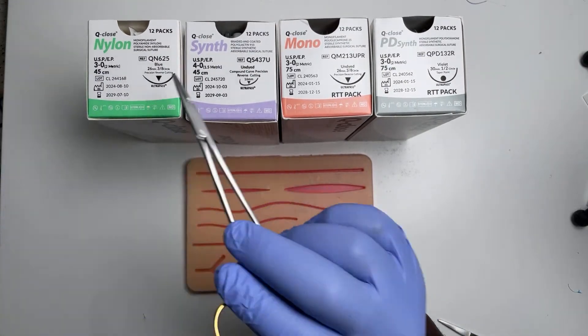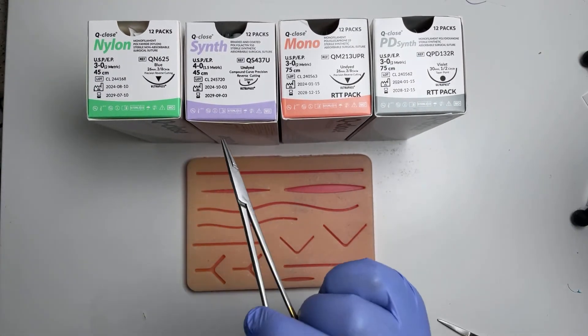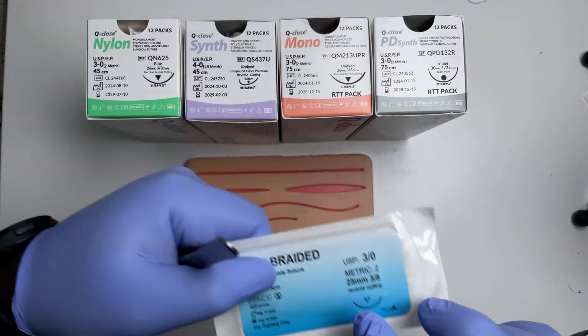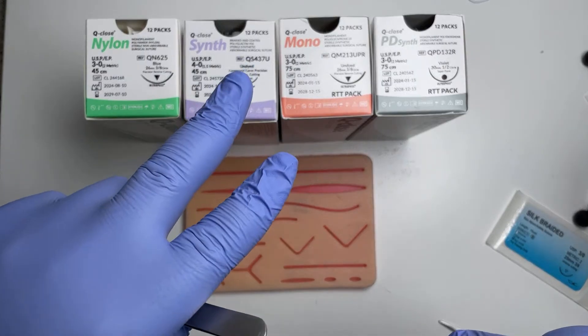You've got monofilament, braided, other braided things include silk, dissolvable, non-dissolvable.